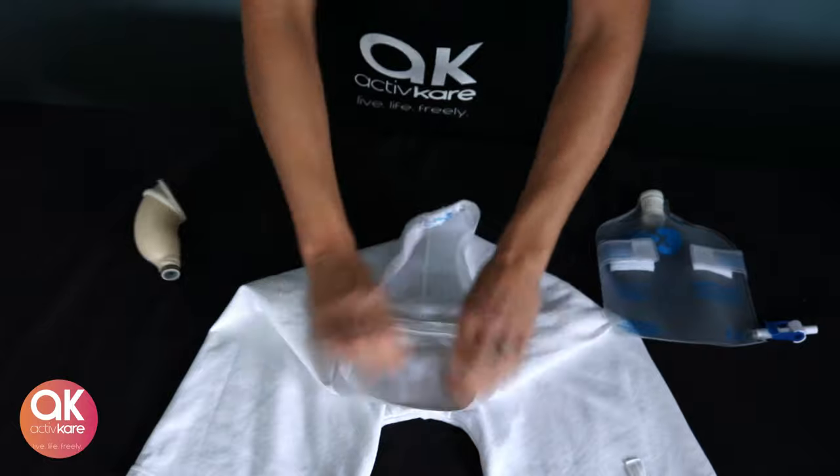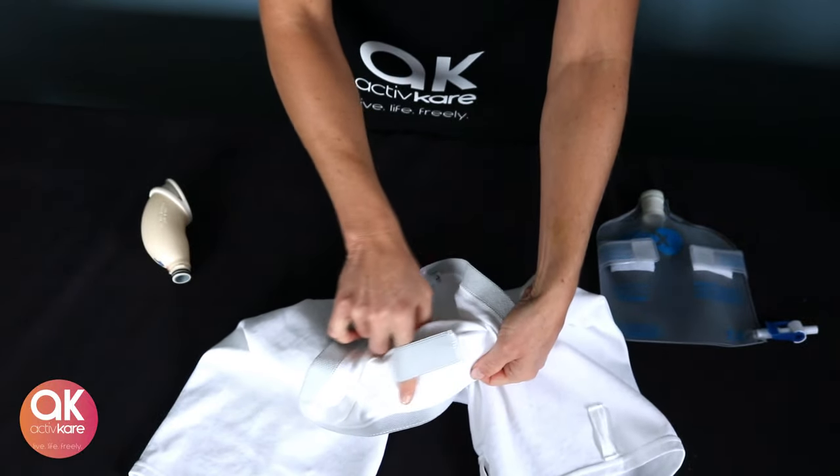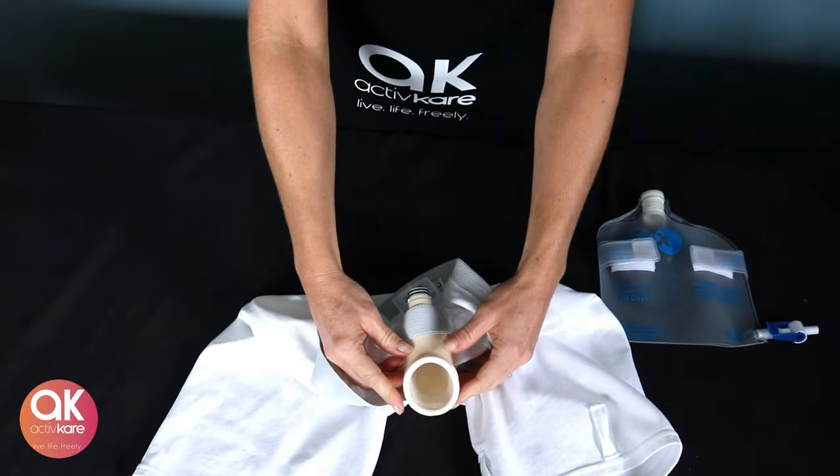Assembly instructions: Every Apex brief has a grey elastic loop to hold the receptacle securely in place. Push the receptacle through the grey loop and through the stitched opening.